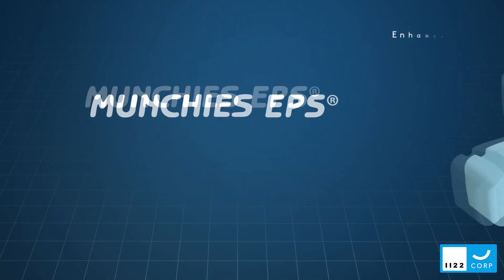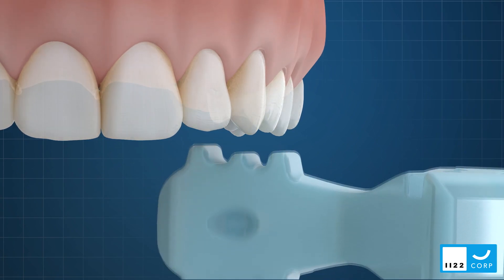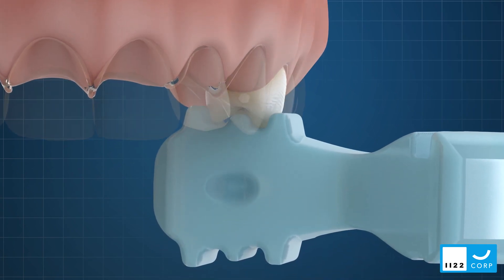The Munchies EPS range has been designed to optimize the seating of aligners in the premolar region in particular, where expansion is often programmed.